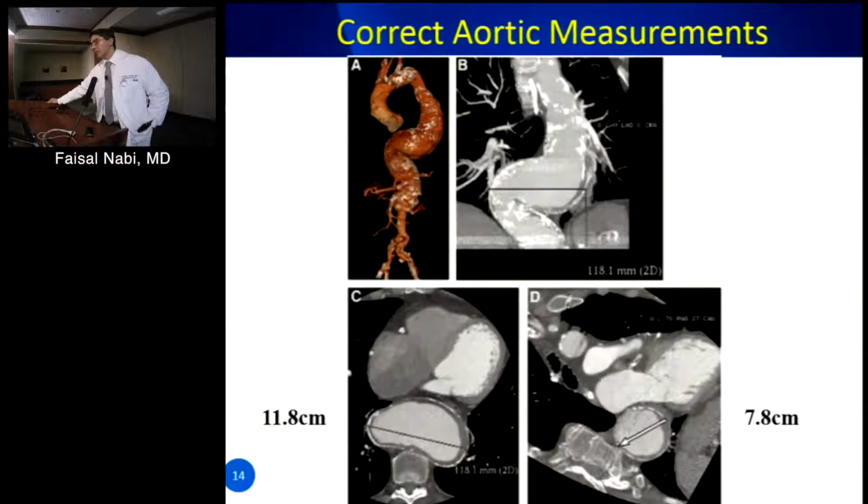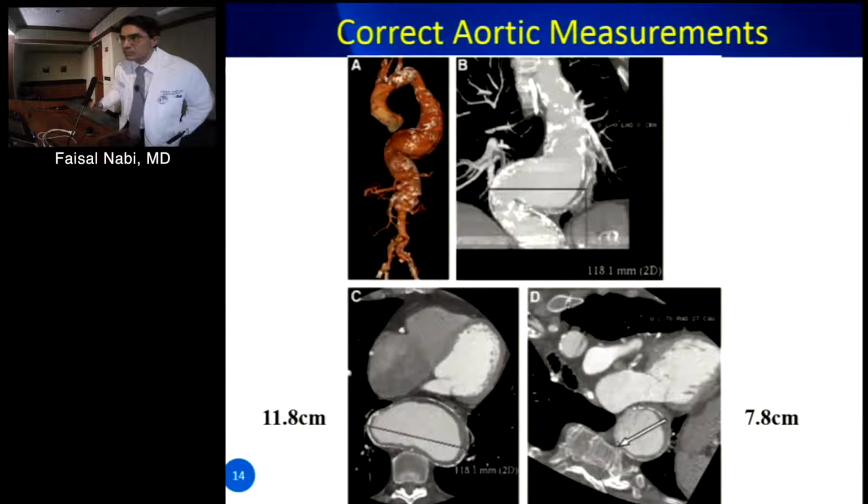So what does the 2016 echo guideline say? Because it's confusing. There are the thoracic aortic guidelines from 2010, and they very clearly spell out that echo is inner to inner. Most of the TAVR literature is leading edge to leading edge, whereas CT is external to external. So what's the chamber dimension echo guideline today?